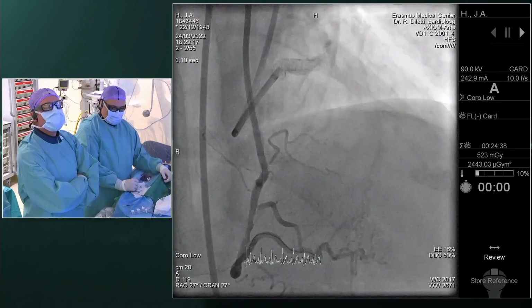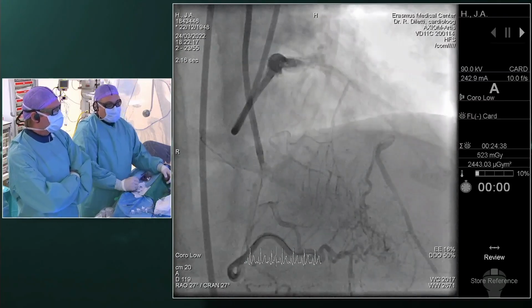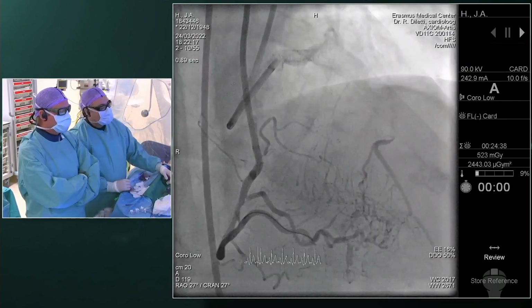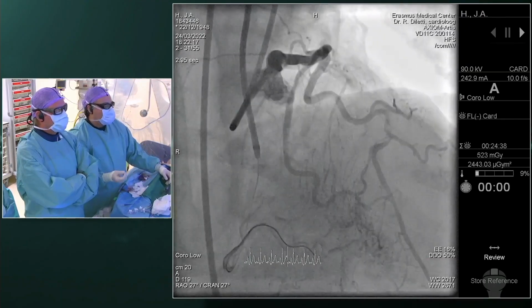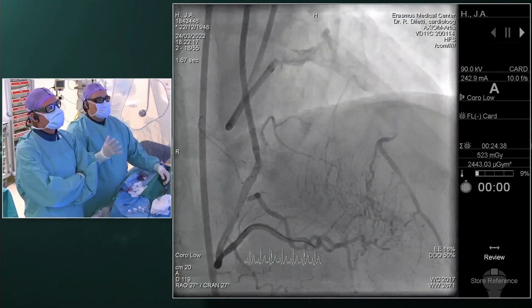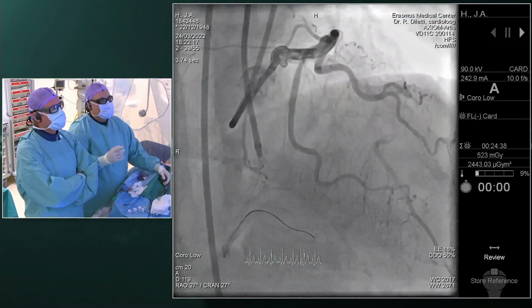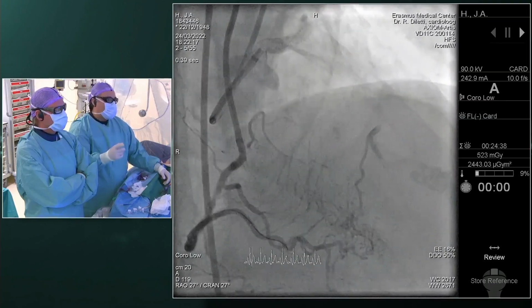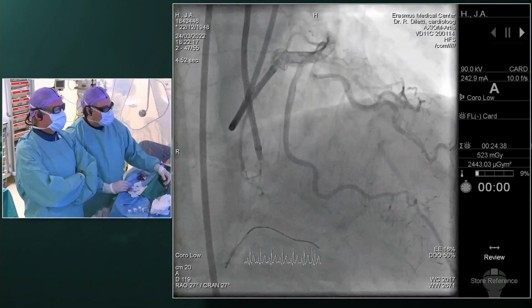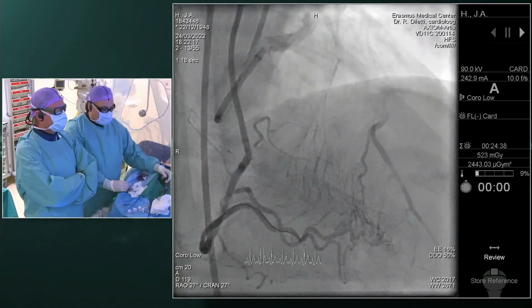Go ahead. No, sure. It's basically also our thinking, because we already have the IVUS ready on the table. We had some feeling of the retrograde approach. We saw that despite having a lot of collaterals there, it is very tortuous. Our wire, we tried a bit, but it's quite challenging to go up with the wire retrograde.